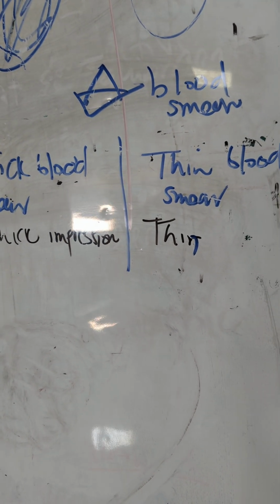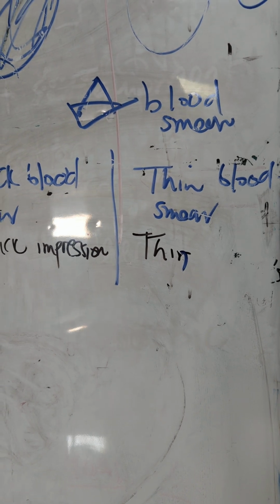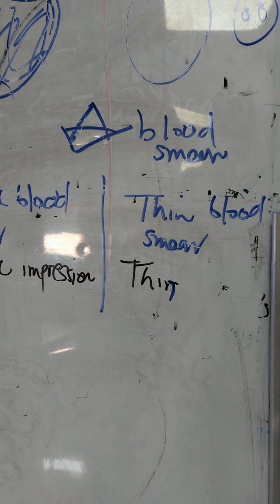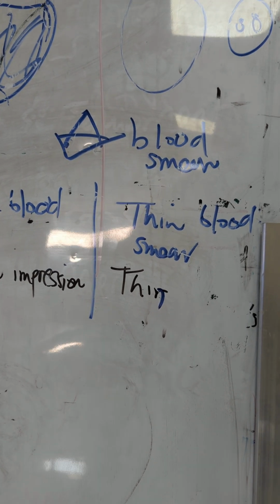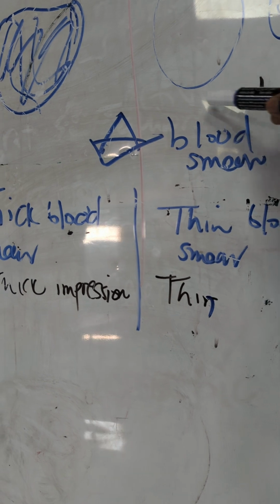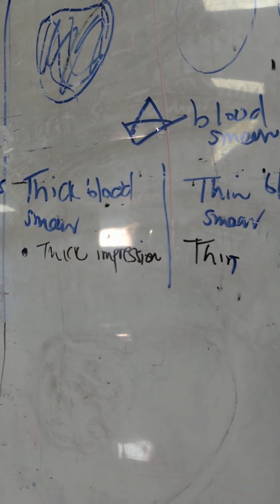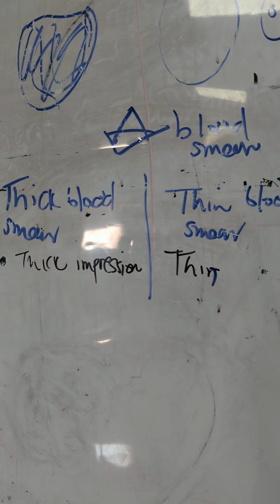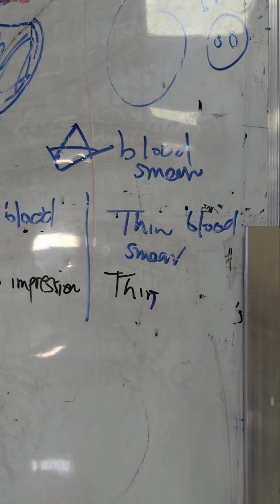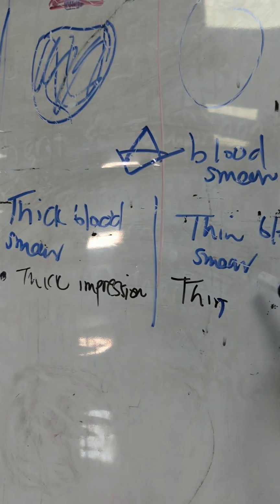What was mentioned in the introductory note was, remember that your parasite resides in the red blood cell, the erythrocytic stage. And so the specimen is a blood specimen, and therefore we are making a blood smear for the microscopy that we are using as a tool. So I quickly run you through the two very important types of smears that are made, which are a thick smear and a thin smear.